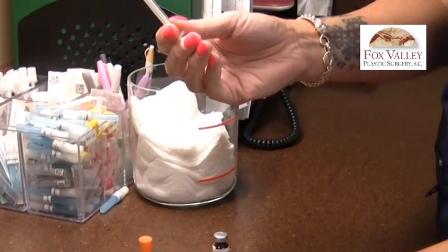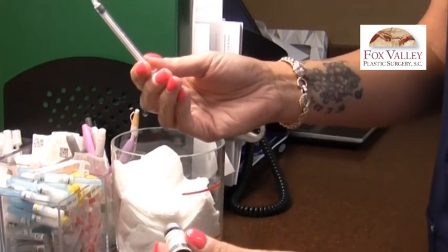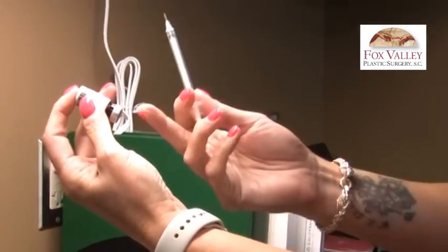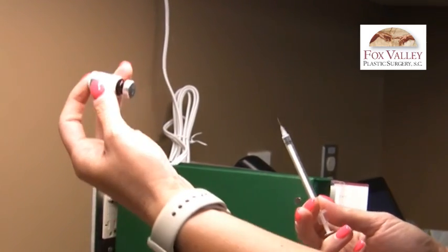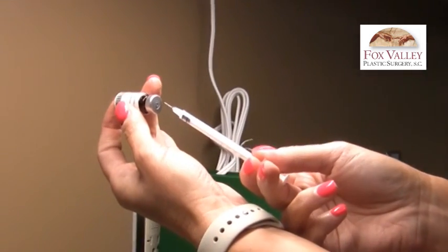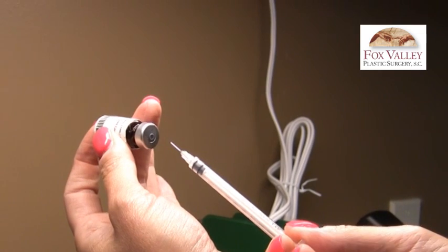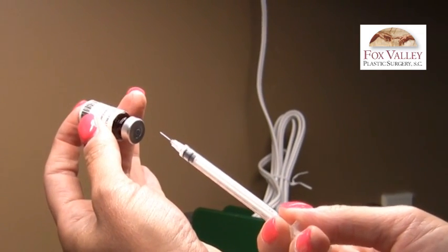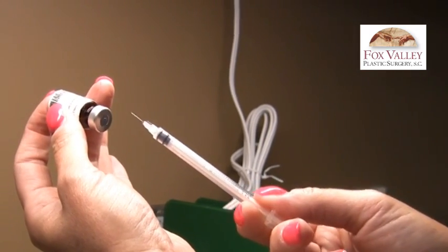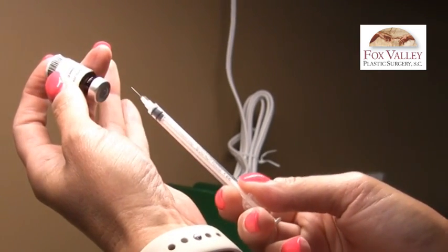There's a very small needle we use. Hold the medication vial upside down to get all of the liquid into the stopper. Aim for the small round circle in the middle of that stopper. If you hit resistance going in, just pull back — it probably means you've gone in a little sideways into the stopper. Pull back gently and reinsert your needle.